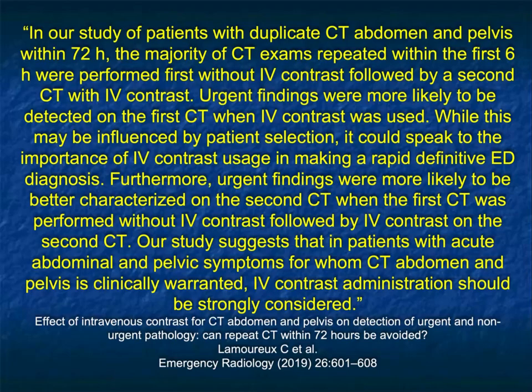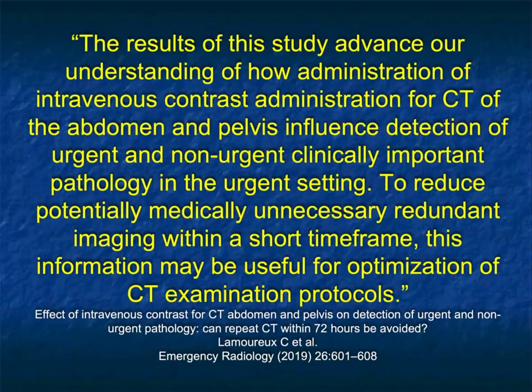We need to make certain that we do the studies correctly the first time. If not, your error rate is going to increase. The result of this study advanced our understanding of how administration of IV contrast for CT of the abdomen and pelvis influences detection of urgent and non-urgent clinically important pathology in the urgent setting. To reduce potentially medically unnecessary redundant imaging within a short time frame, this information may be useful for optimization of CT exam protocols. 100% agree.